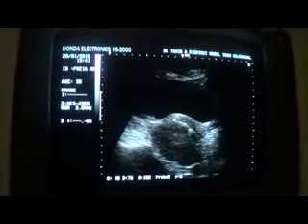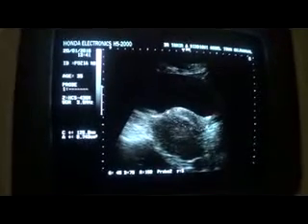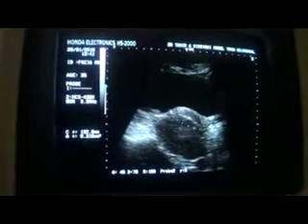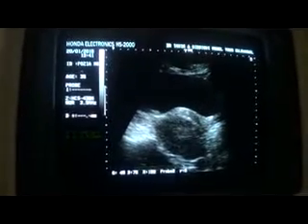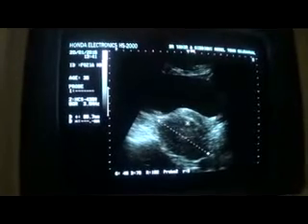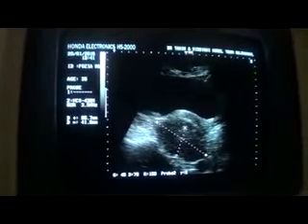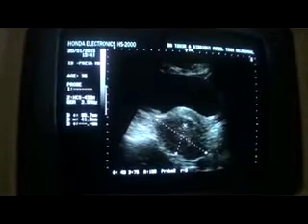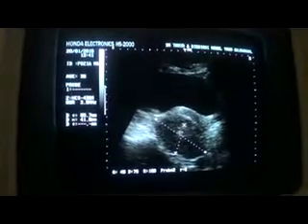Now this is the endometrial canal, and this is the uterus. Then this is the cervix. This area is representative of the cervix. This is the vagina. There is a solid hypoechoic mass seen posterior to the uterus, rather pedunculated, I will say. It extends posteriorly into the pelvic cavity from the uterus and measures approximately 8.5 by 4.1 centimeters.